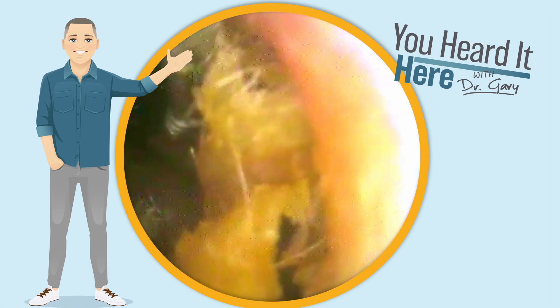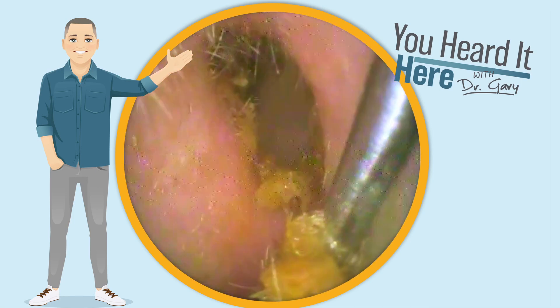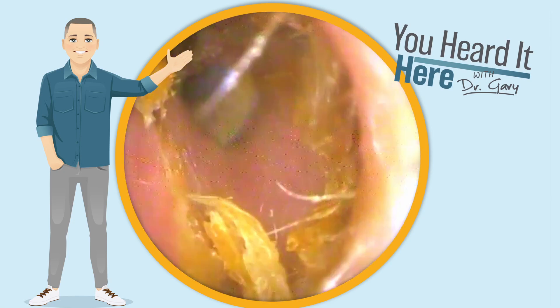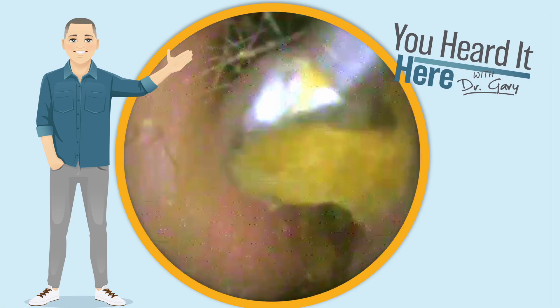What we're removing is a combination of earwax and some drainage from the middle ear. As we get this stuff out of the way, we're going to be able to see the eardrum. We can see how it's a little bit discolored, and then we can see the blue PE tube — it's almost like a straw sticking through that eardrum.